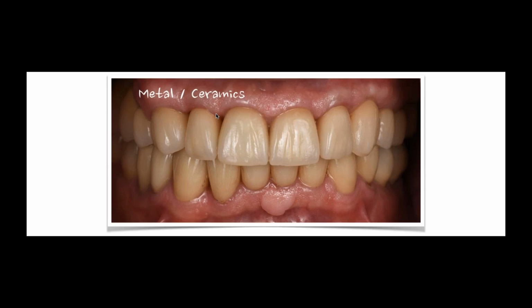And it's nice to make these kind of warmer color cases. We don't get to make them often. I actually enjoy these. But my point is, look at restoratively, look at the depth. And that depth doesn't come just because we put metal ceramics or zirconia or lithium disilicate. It comes because of our understanding of how to mask and allow light transmission from the facial point of view to the inside of the restoration.